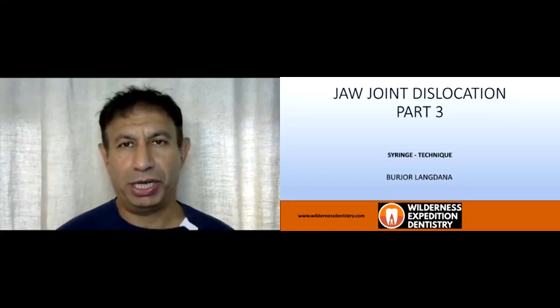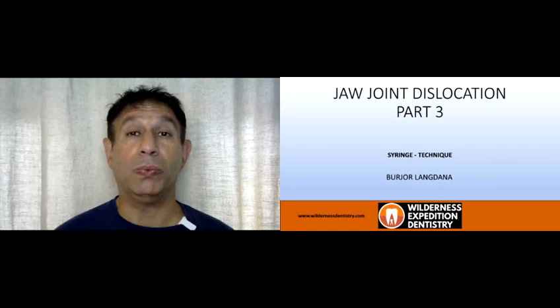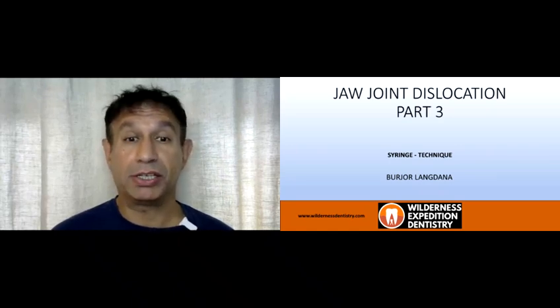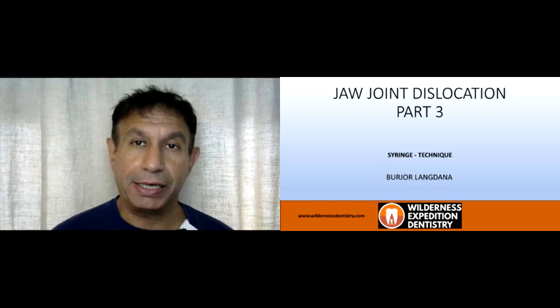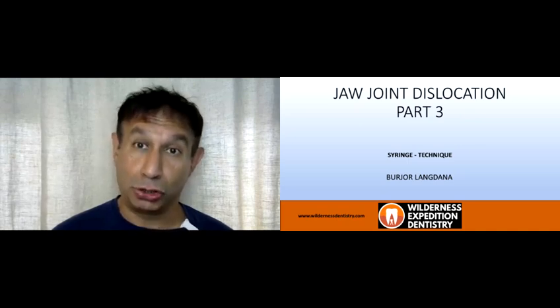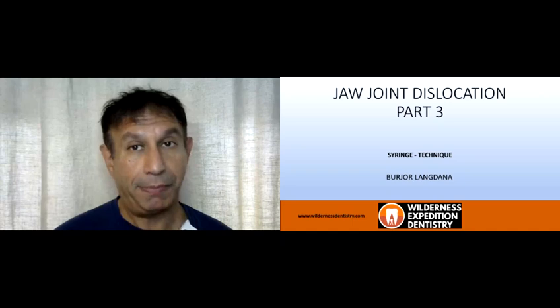Jaw Joint Dislocation Part 3. In this session, we will be discussing the syringe technique to reduce an anteriorly dislocated jaw joint, which is also known as a temporomandibular joint.